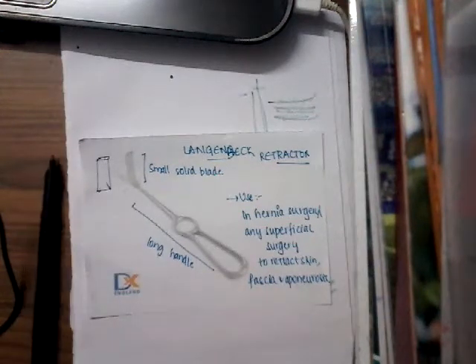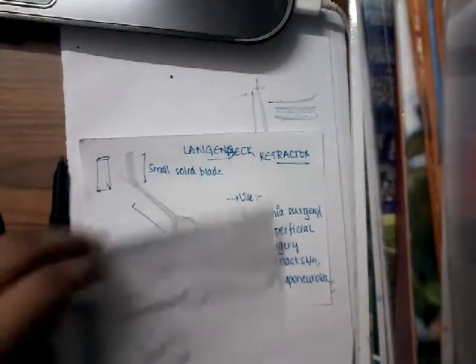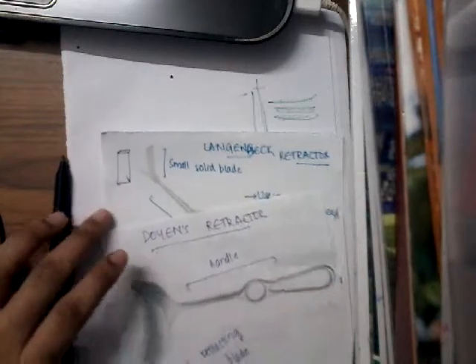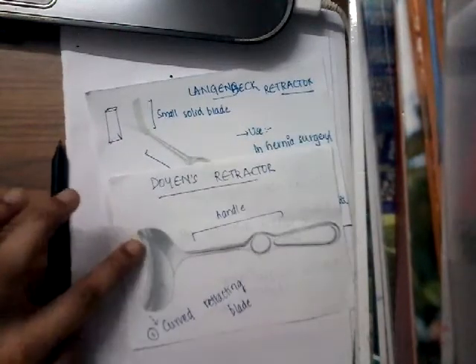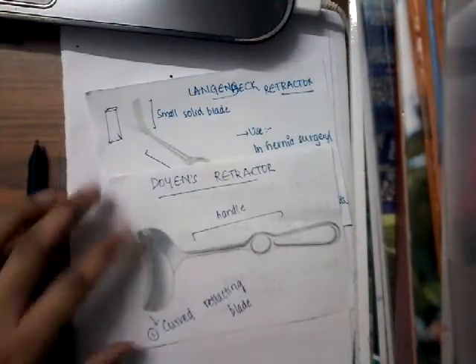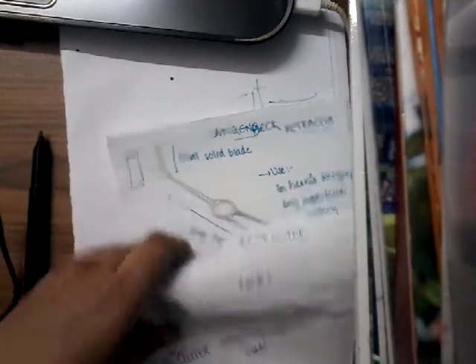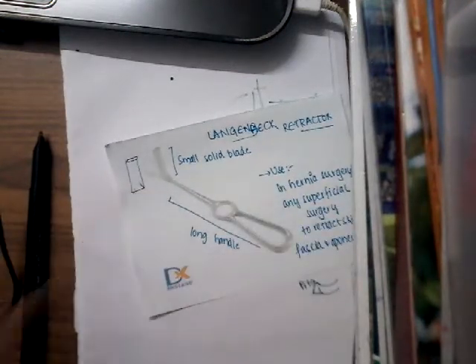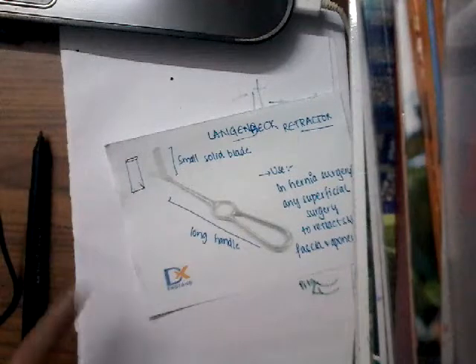If you see the Doyen's retractor, it looks similar in terms of the handle, but the Doyen's retractor has a curved blade, whereas Langenbach's retractor has a straight blade.